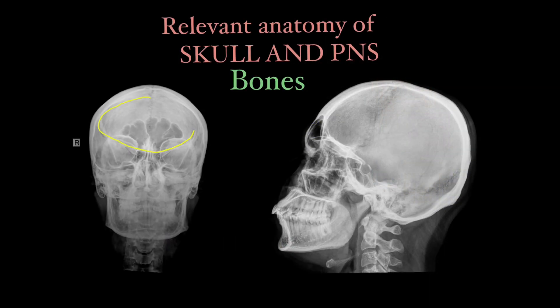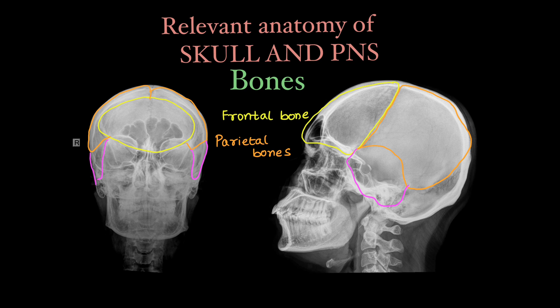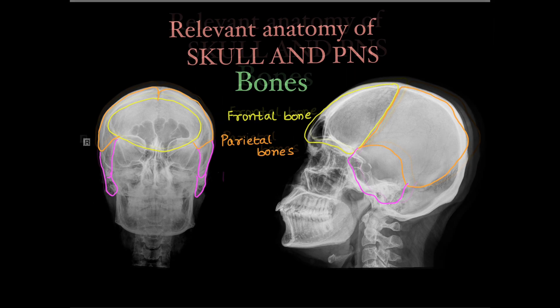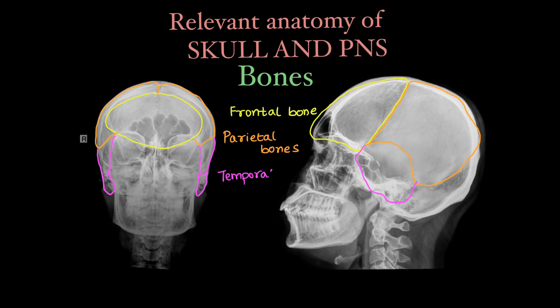First we will look at the bones of the calvaria or the cranial vault. This is the frontal bone in anterior aspect. Posterior superior aspect we have two parietal bones. Lateral aspect we have temporal bones. And in the posterior aspect we have the occipital bone.